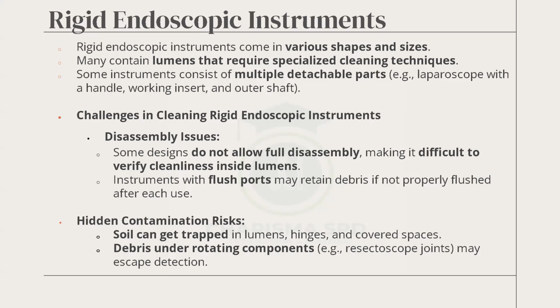All right, so different rigid and semi-rigid endoscopes are there. Some have what? Lumens, some do not. You see a lens and you still see a tiny hole that goes through it. For example, semi-rigid endoscopes have two channels that the director was showing us with the cursor. Those lumens need to be what? Flushed. Instrument pieces go in there.